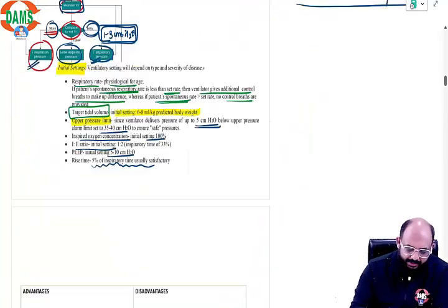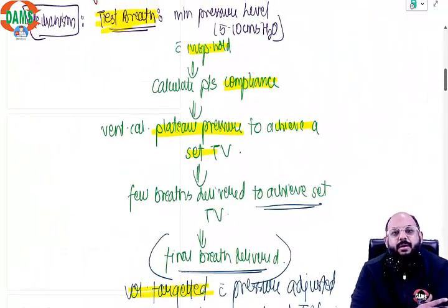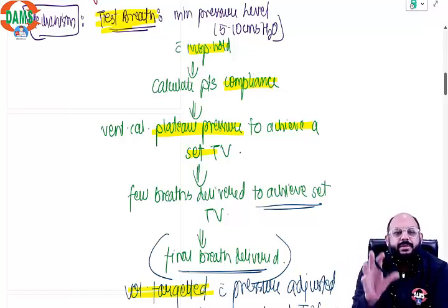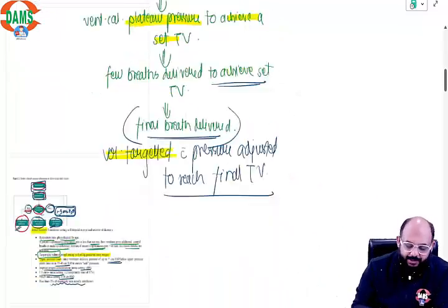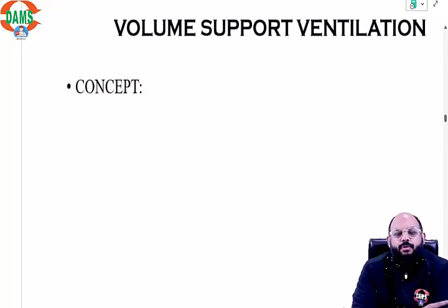So it usually comes as a short note, but it is also something that will be asked to you in the Viva, because this is a mode of ventilation that we commonly have in our anesthesia ventilators. Okay. So this is PRVC. This is pressure regulated volume control, PRVC.